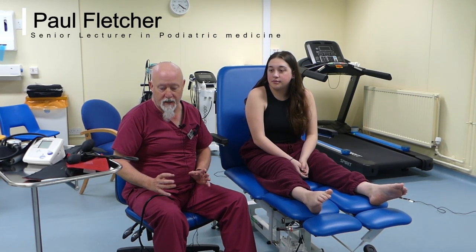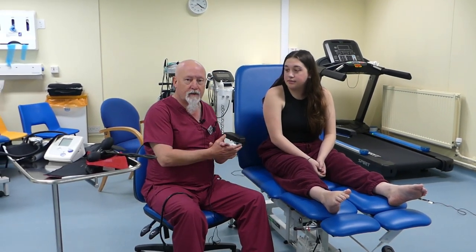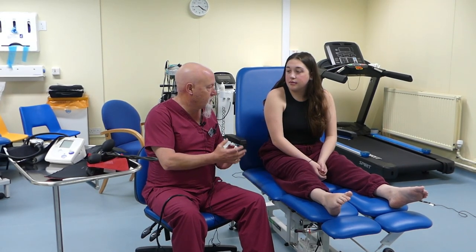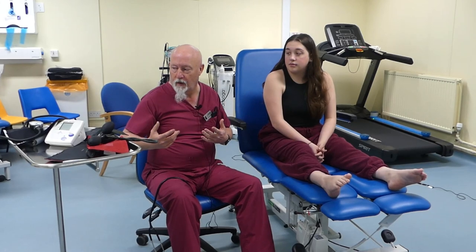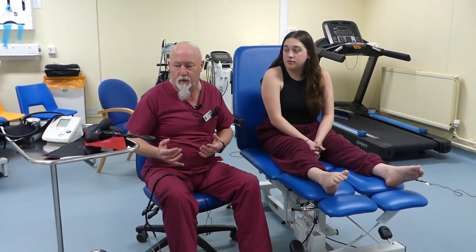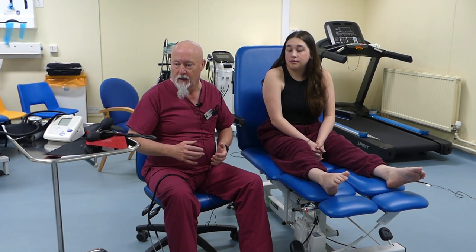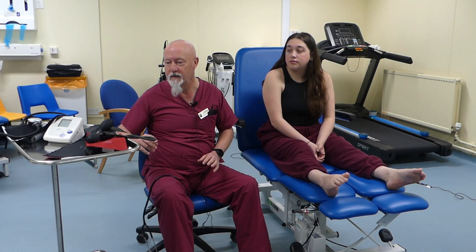Hello, this is the first year blood pressure OSCE station that we're going to have a look at today. All you're expected to do is just take a systolic and diastolic pressure in the arm of one of the second year students who will be volunteering, or it may be one of the members of staff if we don't get enough volunteers.